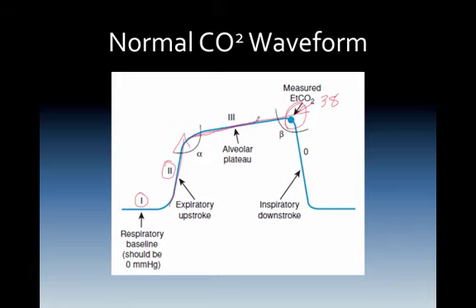This alveolar plateau here that we take a look at in phase 3, characterized by exhalation of mostly alveolar gases. The highest point is the end-tidal CO2 value, and that is recorded and displayed by the monitor. Peak concentration of CO2 occurs at the end of expiration. The millisecond before inhalation is the maximum amount of CO2, or the end-tidal CO2. And that would be this number up here that we've already talked about. This is the alveolar plateau. Slowly rises until it is at a peak measurement.